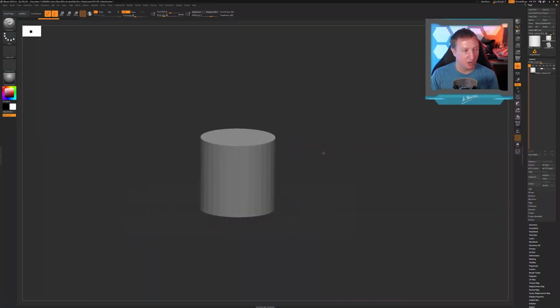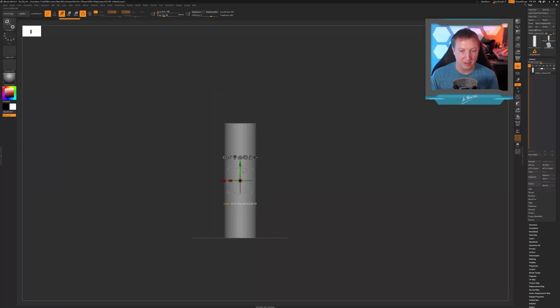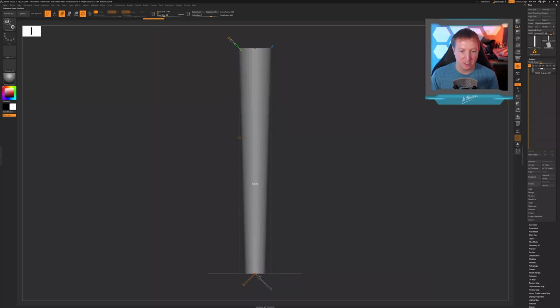So I've got a cylinder up in my workspace here, and the first thing I'm going to do is make the shaft of the screw. So I'm going to lengthen this out to the size that I want it, which is about there, and maybe just a touch longer. And I'm going to come over here to my move menu, and I'm going to go to bend curve. What it's going to allow me to do is to create a narrowing of the shaft of the screw throughout the diameter of it to here.